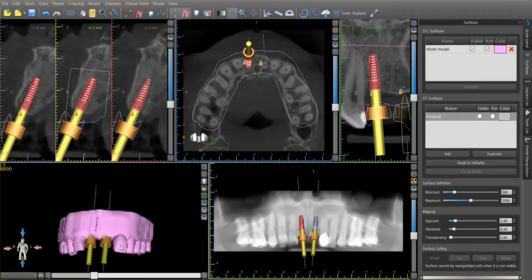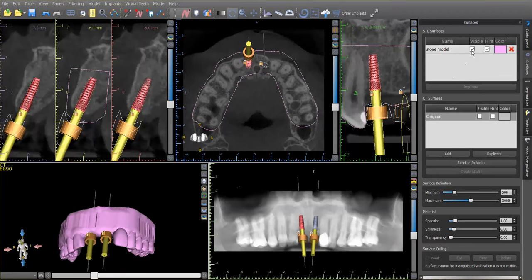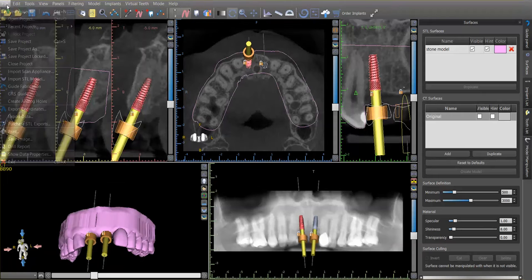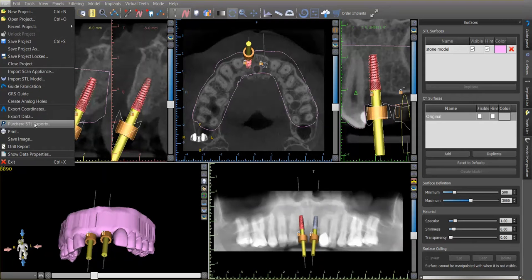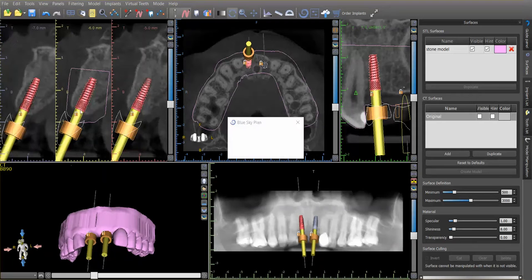We're just going to turn on the one model that we want to do this on. So go to File, push Create Analog Holes.